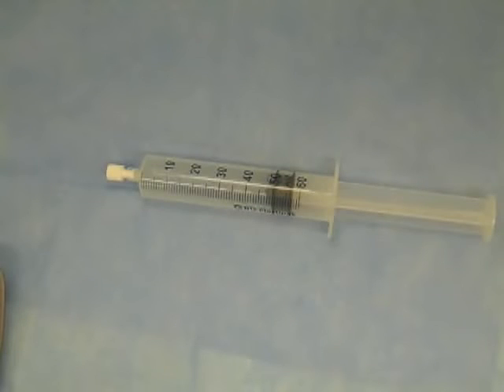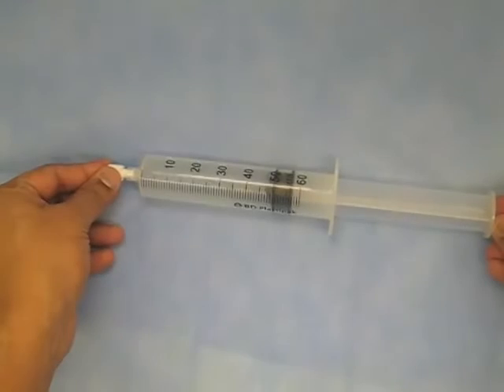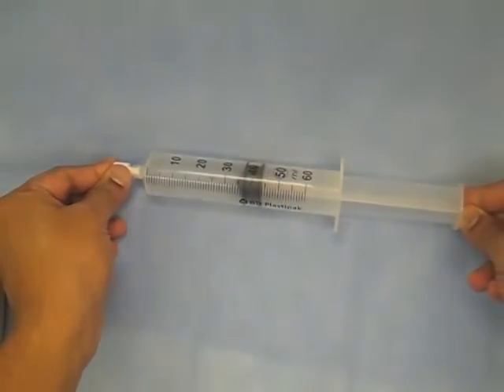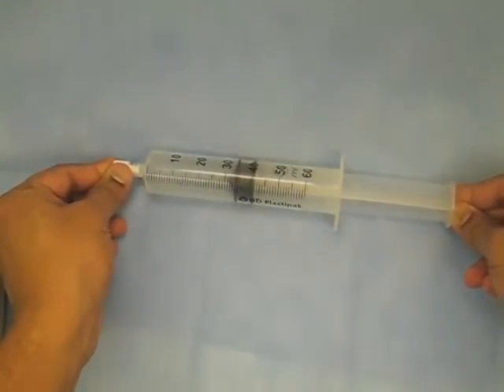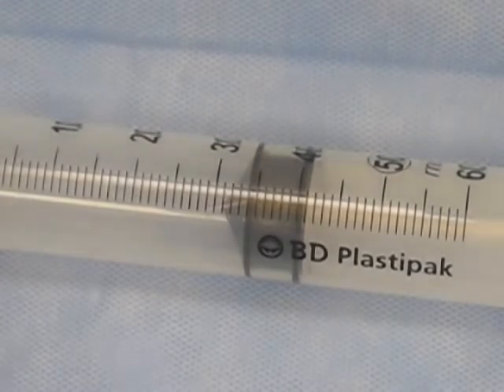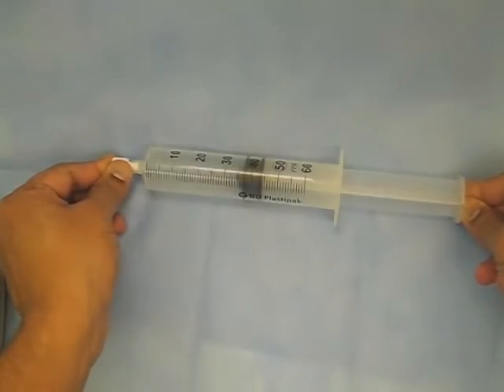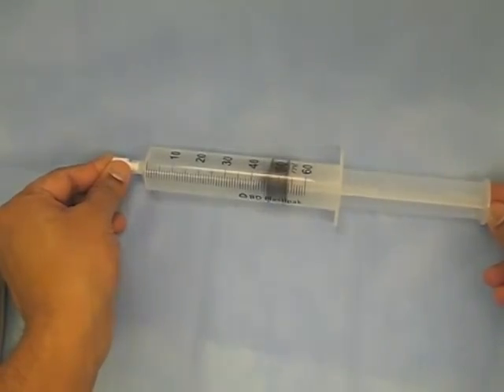A much easier way of practicing is by using a capped 50 ml syringe with the plunger pulled back to 50 ml. Depressing the plunger to 34 ml is equivalent to application of 30 newtons of pressure. The difficult part in training and clinical practice is to sustain the cricoid pressure of 30 newtons until the confirmation of endotracheal intubation.